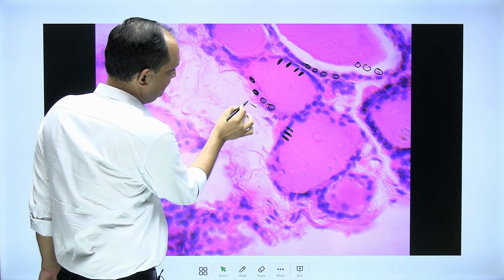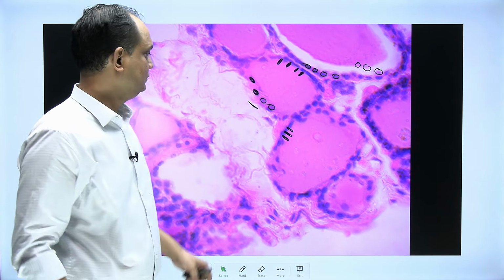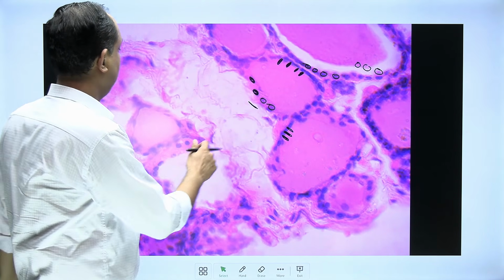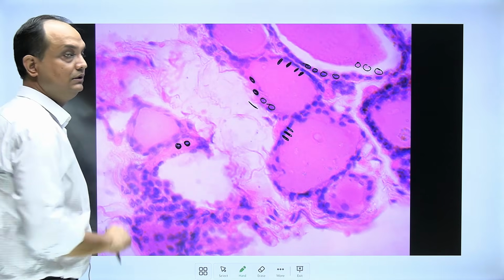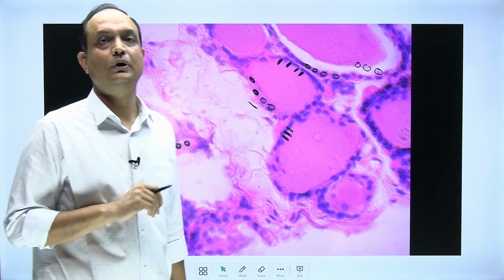And they are not flat. The flat cells are just like this, a line. They do not appear as more than a line. So this is a basic difference between the squamous, columnar and cuboidal. Right now you are dealing with the epithelium which has round cells and round nuclei, and this round nuclei is a classical feature of cuboidal epithelium.